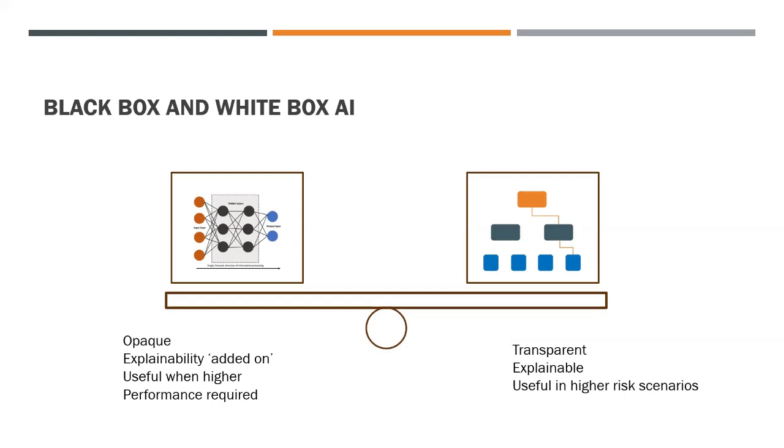And this would have been the case with types of mammography CAD being used in the 80s and 90s, where we were able to understand that the system may overcall, but we could accept this because we were able to understand how the system was going wrong. And as I mentioned, this is not the case with deep learning systems, where, when mistakes are made, sometimes it isn't understandable why it does it.